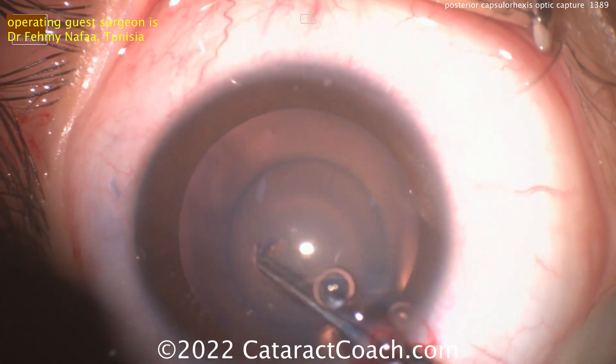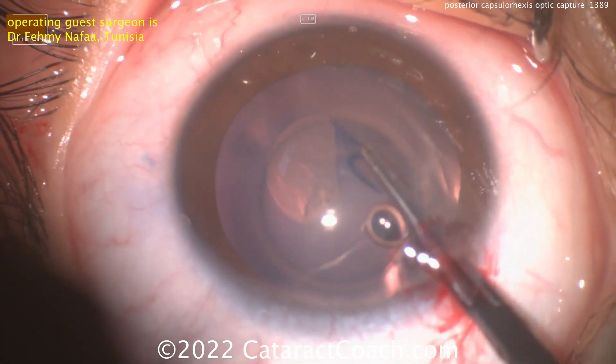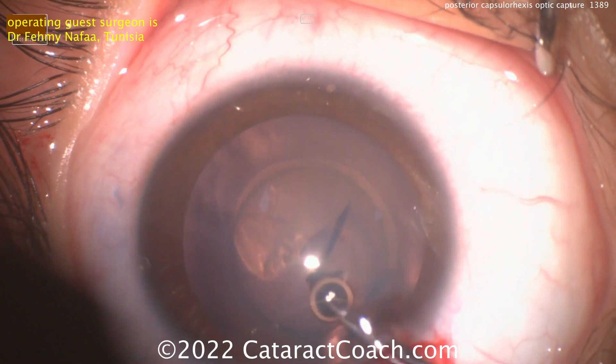Starting it off here, going conservative. You can always enlarge it or spiral it out. I like the technique here — very nicely done, just tracing that quite nicely.